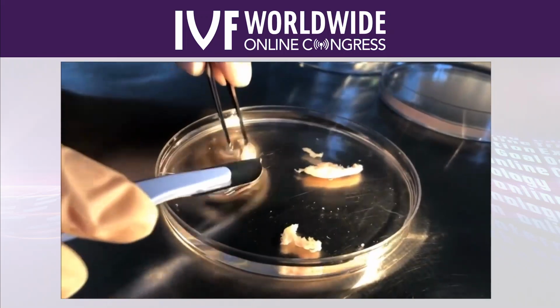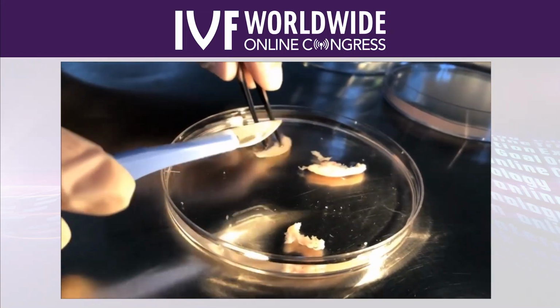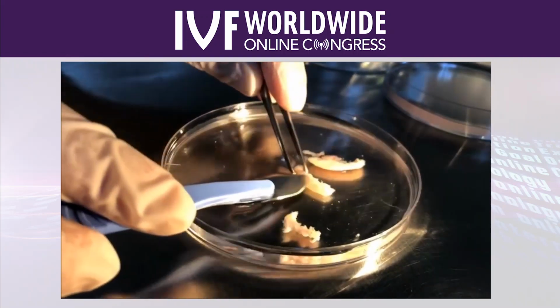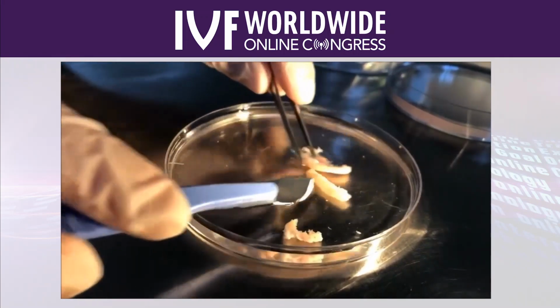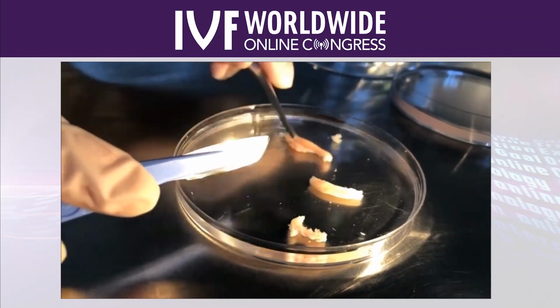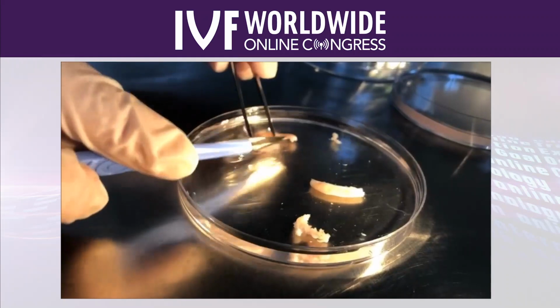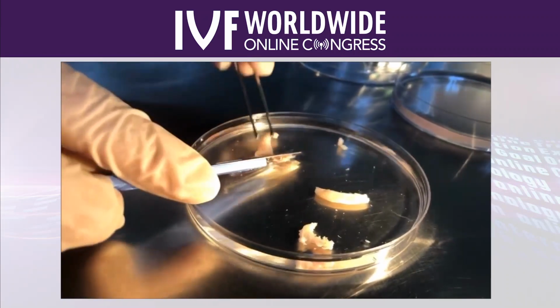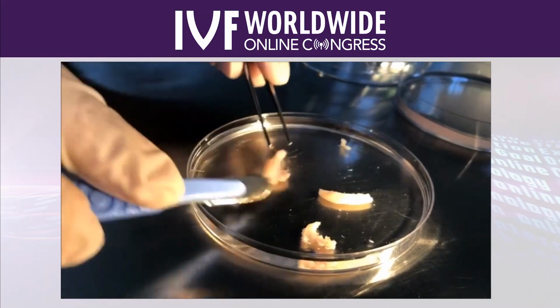And here we are removing some connective tissues. But we are getting there. Here you can see one piece has been prepared. And then there's a little bit of medulla up here floating around. And then we're cutting away a little more of the connective tissue.